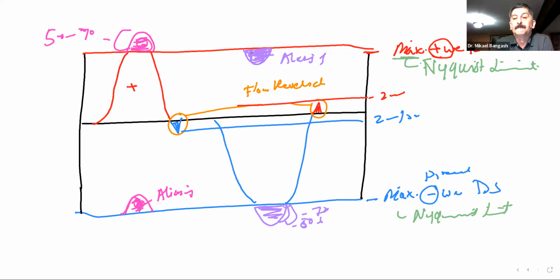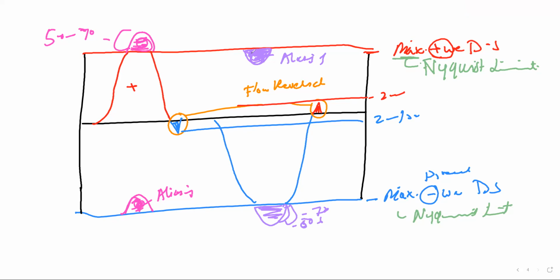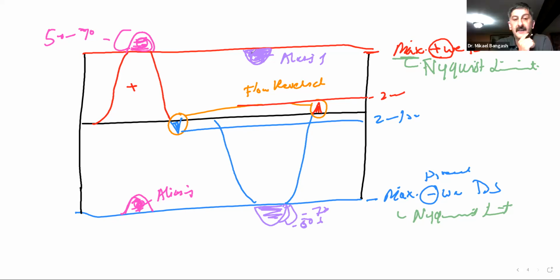Is that clear? Any questions? Yes, the Nyquist limit, it's adjustable, right? You could change the limit. Yes, we can change it. How we change it, we will come to that in just a little bit.